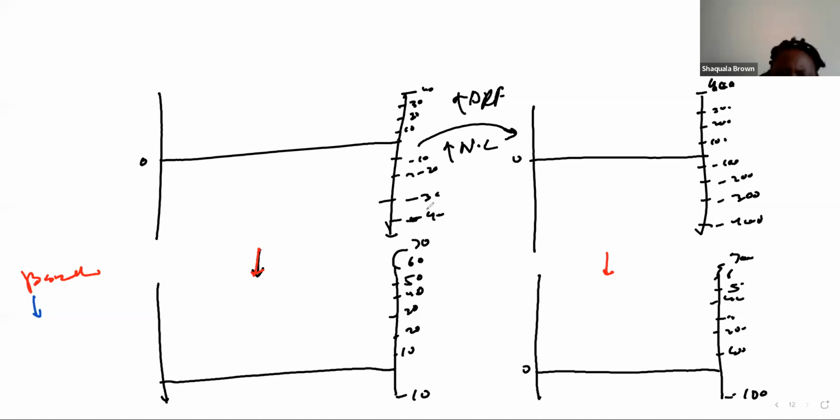That's why, in this case, we move the baseline down. Now this point became your new zero Doppler shift, or new application of the baseline. But you may have just kept it, because you're still going to be able to measure up to minus 10 centimeters, positive, negative Doppler shift, right?